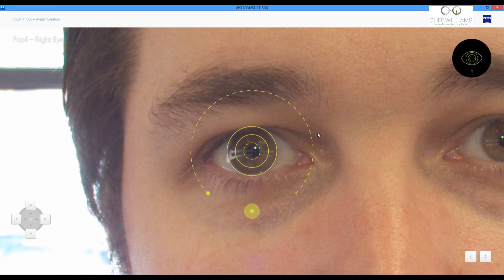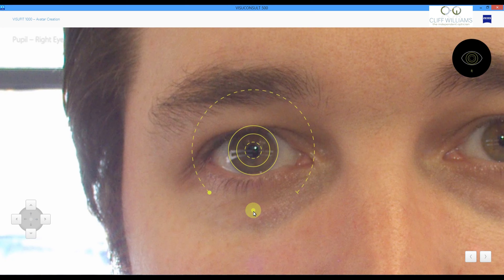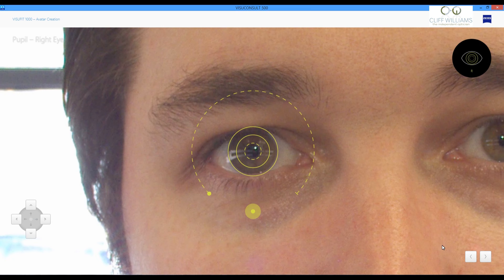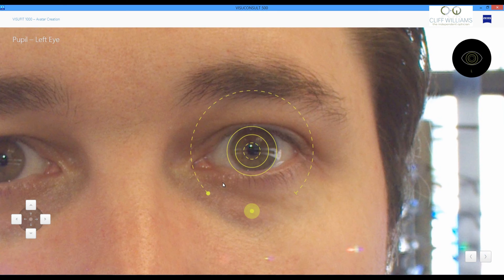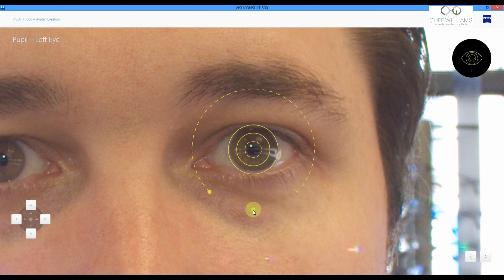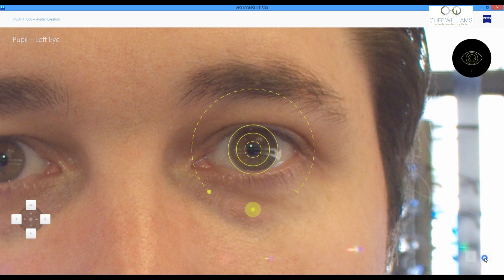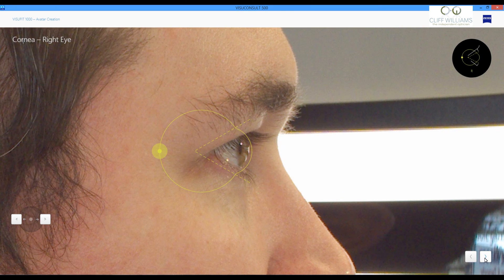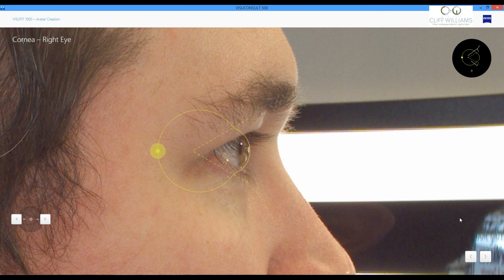We find the centre of the eye. We do that for the other side as well. And the next step is to do the cornea. Show where that is. And again do it for the other eye.